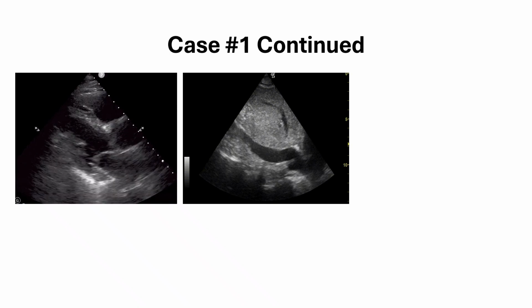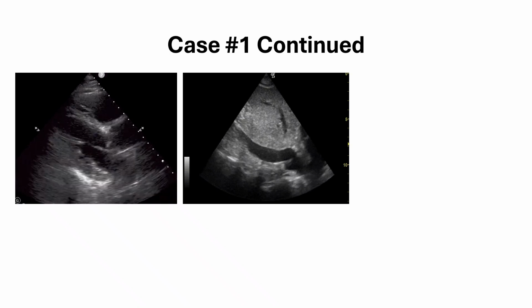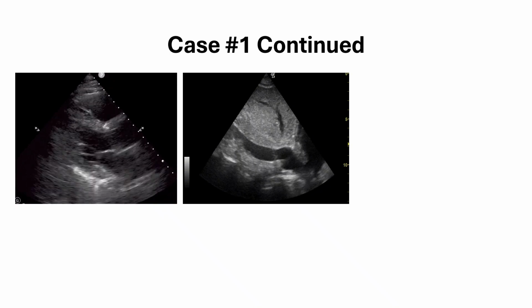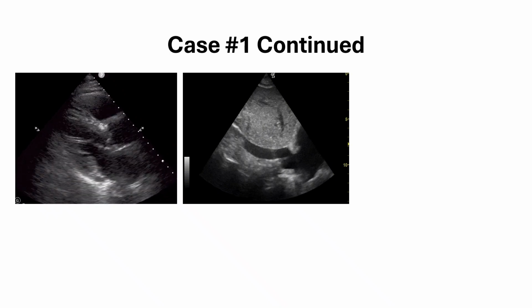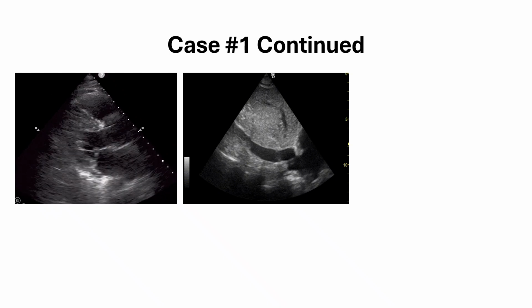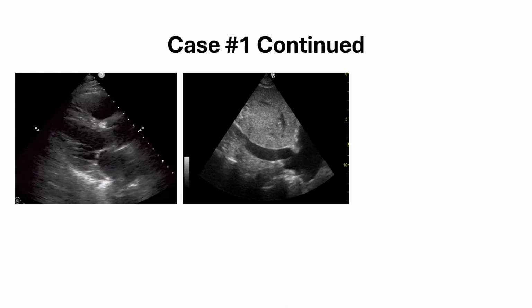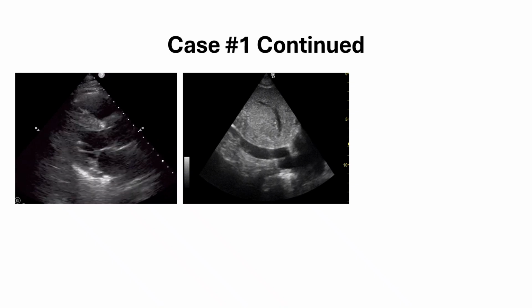So next you look at the inferior vena cava, or IVC. Please pause the video if you need to understand this image a bit better. In this particular view, the IVC is kind of equivocal. It's really hard to make much of it. It's not really slit, which would suggest hypovolemia, but it's also not really dilated and full, which would suggest an obstructive or cardiogenic shock component.